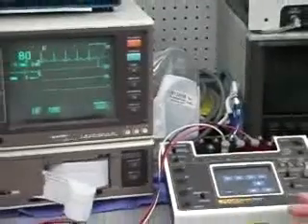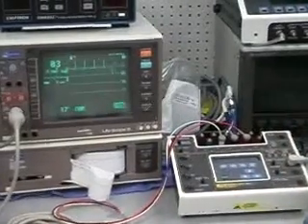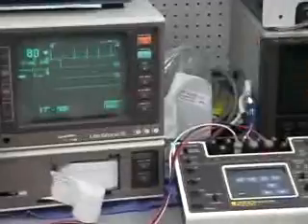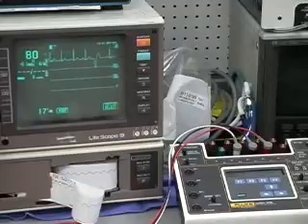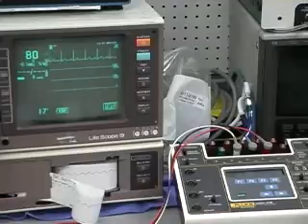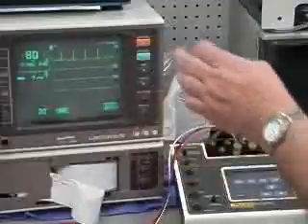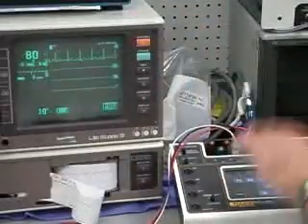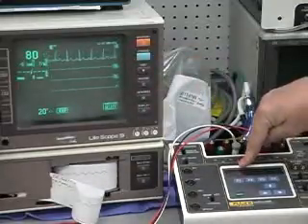So especially if you're looking at an arrhythmia counting system, that's what these have, you can use this for checking them out. So let's say, okay, this has the ability for measuring arrhythmia activity, ventricular arrhythmia activity. Okay, so let's run something that's X number of PVCs per minute. And so we'll clear this, set up the monitor, start that, and then start that one. And now you're running PVCs. We're counting them because we know what we're doing.